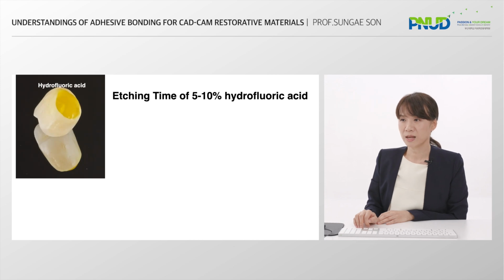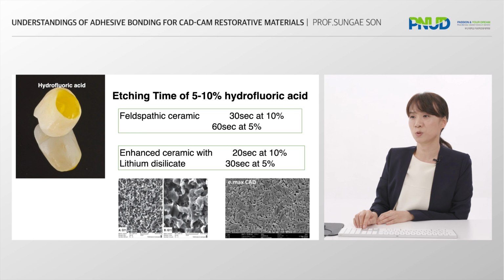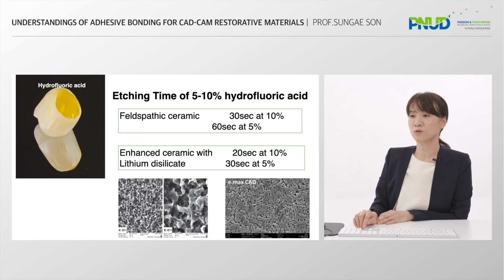This is the recommendation for hydrofluoric acid etching time of a silicate ceramic block. Usually for enhanced ceramic, such as lithium disilicate, 10% hydrofluoric acid requires 20 seconds of etching time, and 5% hydrofluoric acid requires 30 seconds of etching time.